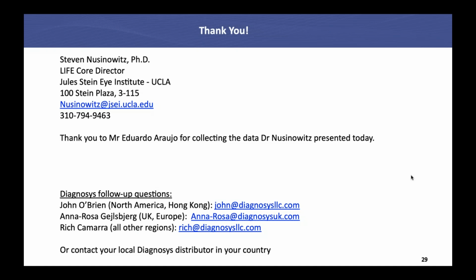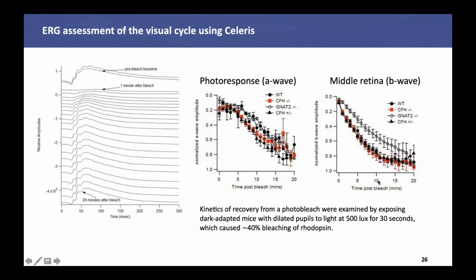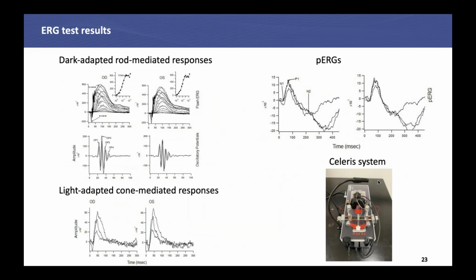The first was whether the touch-touch protocol allows for obtaining an ERG from both eyes. And the answer is yes. It will typically interleave flashes. If you assume that you want to wait, say, 10 seconds in between flashes, you'll set the interstimulus interval to 5 seconds instead of 10.